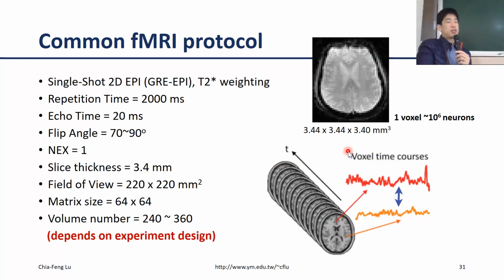And this is a general protocol, since we are going to visit our 3T MRI facility this semester. I think I had better show you the protocol, that means the essential parameters that we normally use to perform an fMRI imaging.